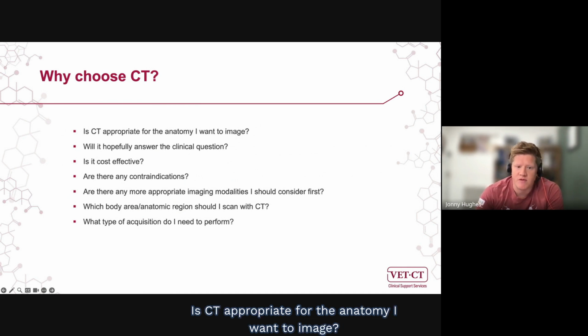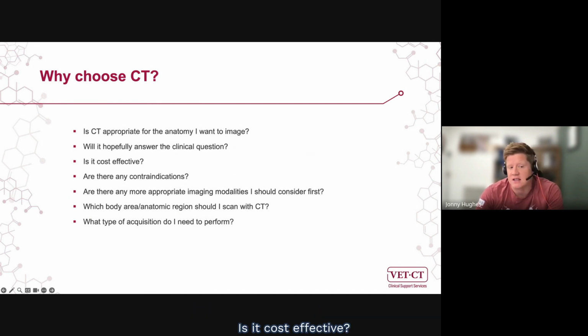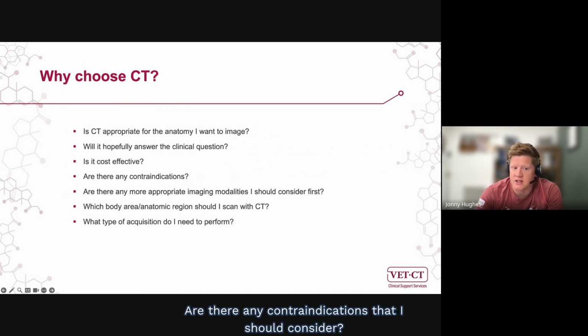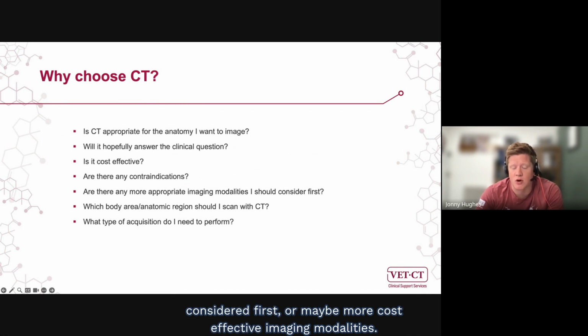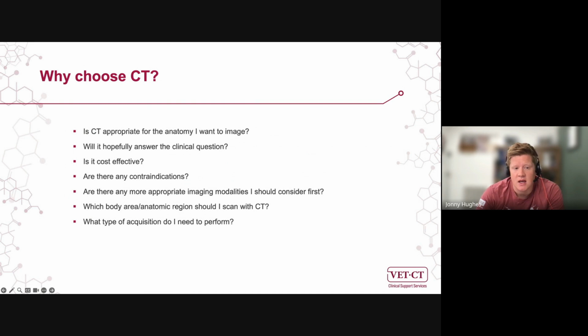Is CT appropriate for the anatomy I want to image? Will it hopefully answer the clinical question that I have in mind? Is it cost effective? Are there any contraindications that I should consider? And it may be that there are more appropriate imaging modalities to be considered first, or maybe more cost-effective imaging modalities.